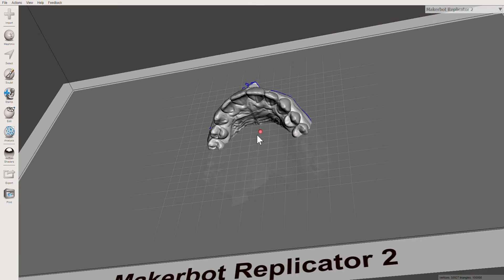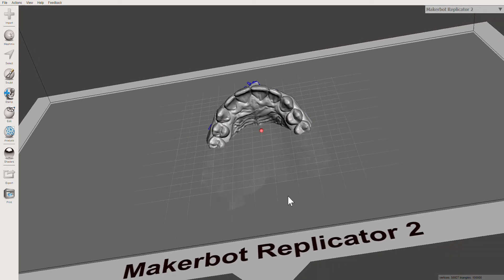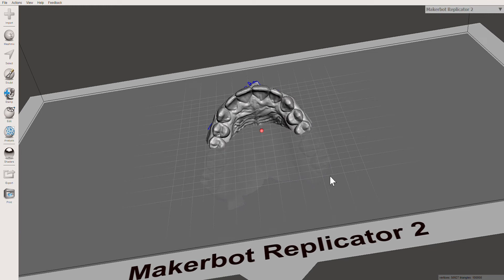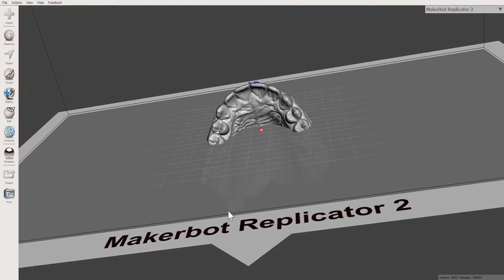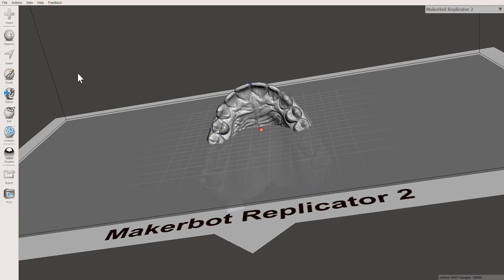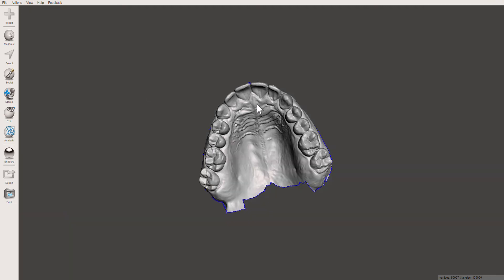The first thing you'll notice is that there's a grid and a printer bed. I typically don't like to edit with them on, so I'm going to turn them off by going into View, deselecting 'Show Grid' and deselecting 'Show Printer Bed.' Now we've got this free-floating STL model.